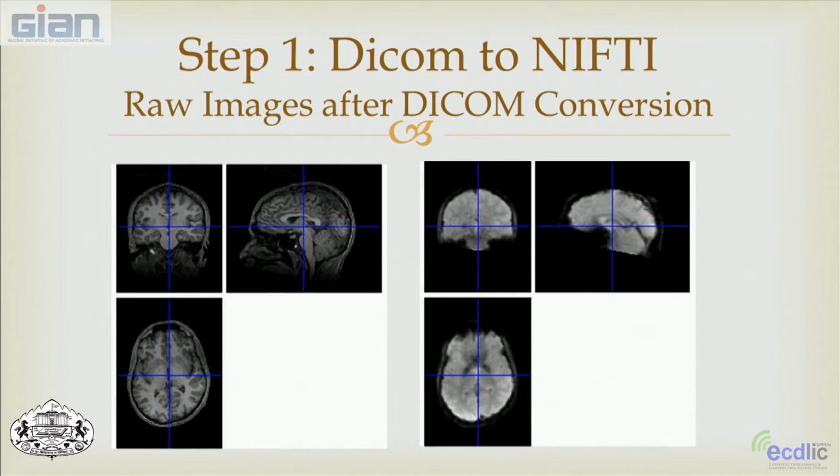What we do initially, again, is we collect the data, and we take the raw data and we convert these Dicom files, which are the raw data that comes directly from the scanner. These Dicom files have already had the two-dimensional spatial Fourier transform employed, so they are actual image space data. And we take these and convert them to what we call NIFTI format, which is a format that our programs can read.